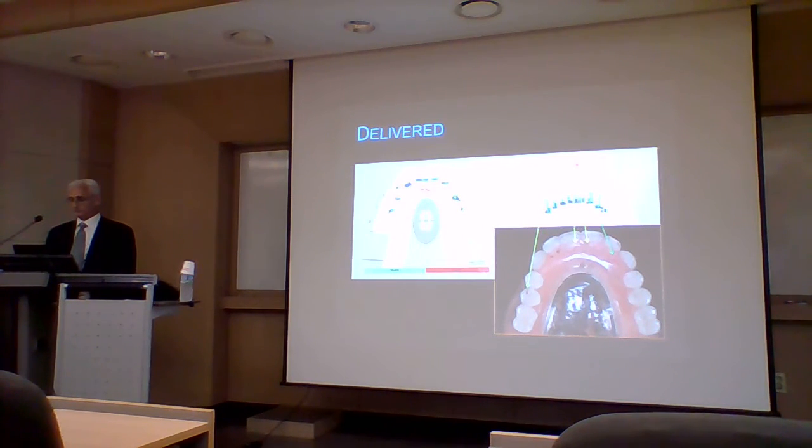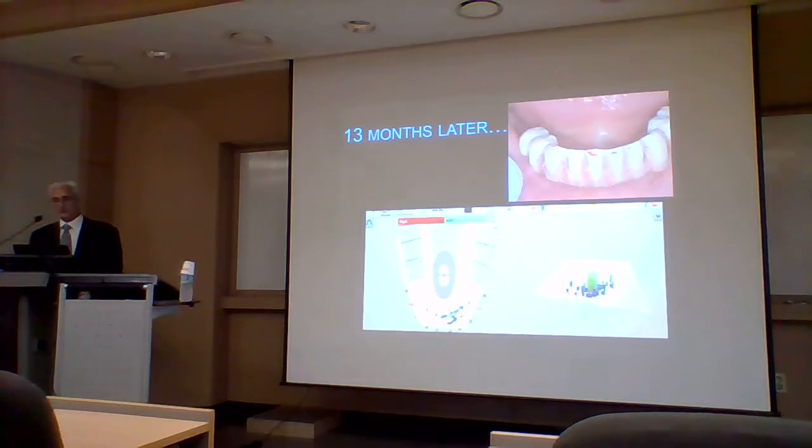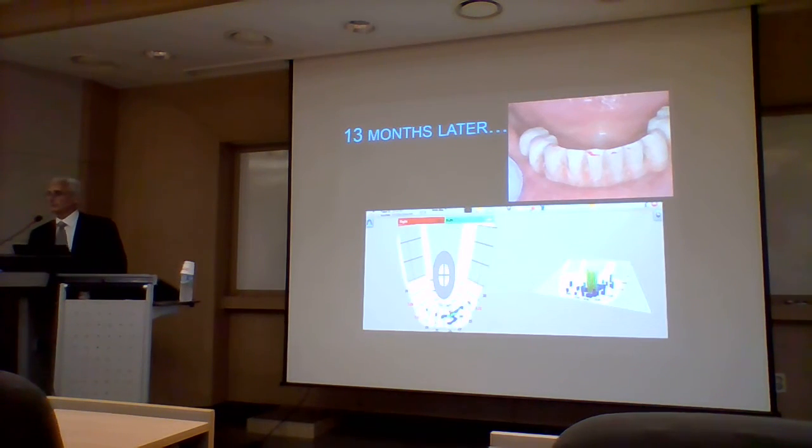Now then, 13 months later, the patient came back for recall, and I always scan these patients again to see how they're doing. And sure enough, wear and tear on the prosthesis created a force imbalance in this region.